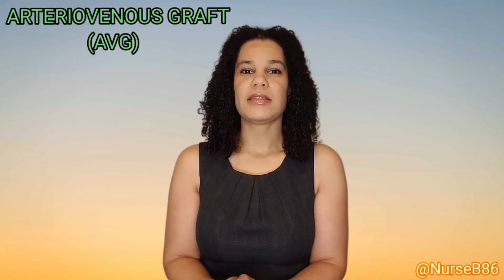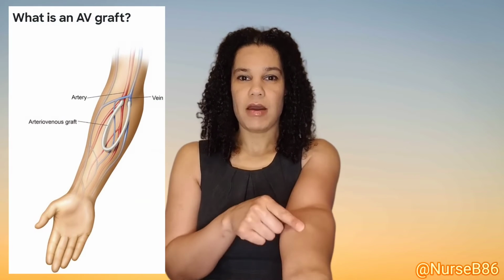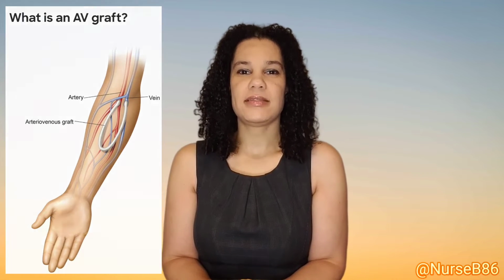Second type is the arteriovenous graft or AVG. This also connects the vein to the artery in the arm or the leg by placing a hollow and synthetic tube. One end of the tube will be connected to the artery and the other to the vein. This provides a flow rate of blood suitable for dialysis.